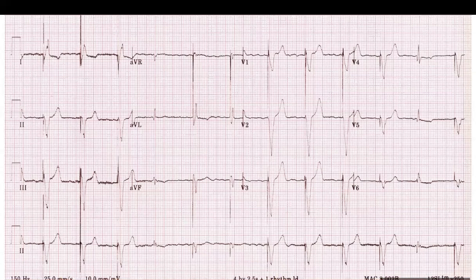You said there is intrinsic, right? Yes. Okay, how does the pacemaker know that there is intrinsic? Well, there is no P wave before that, or unclear P wave. Just ignore the atrial activity. So now you have a ventricular pacer at least. So there is pacing, spike, and capture, but the fourth one, there is an intrinsic activity here. Right? Yes. So if you have a pacemaker, why didn't this pacemaker fire here?